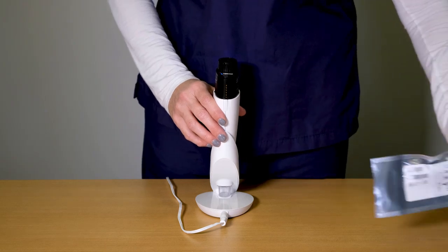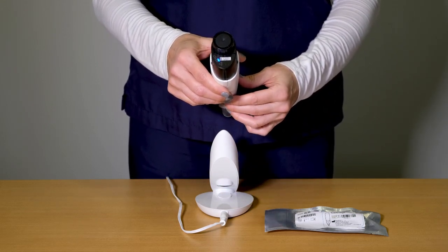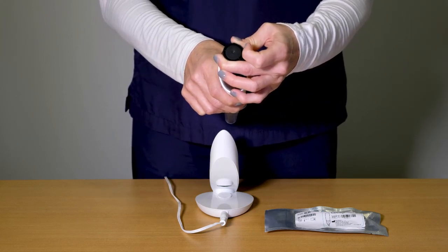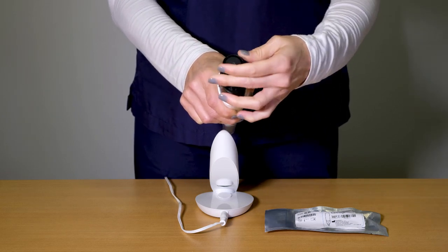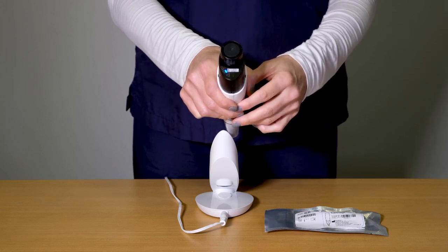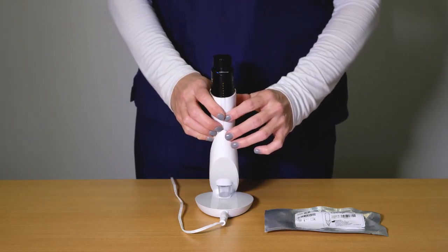Once the smart tip is attached, it is time to replace the nitrous oxide cartridge. Always point the cartridge towards a safe location, away from the user, patient, and bystanders. Orientation is important — the smart tip should be pointing down. Turn the cartridge cap counter-clockwise until you hear a pop or hiss of venting nitrous oxide. Allow the system to fully depressurize — up to 45 seconds — before entirely removing the cartridge cap. Exercise caution when removing the cartridge as it may be very cold.